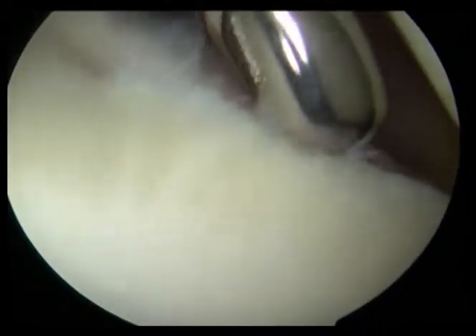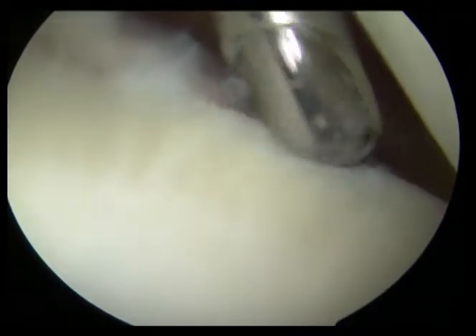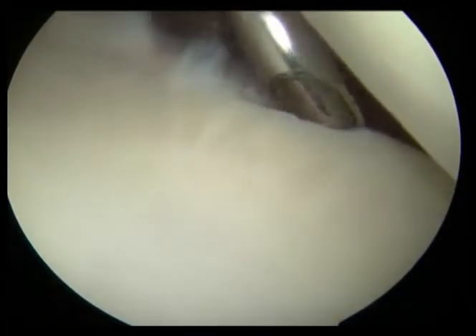Here we are freshening up the surface of the bone to receive the labral repair. We're using a shaver that helps remove old tissue and non-viable tissue.